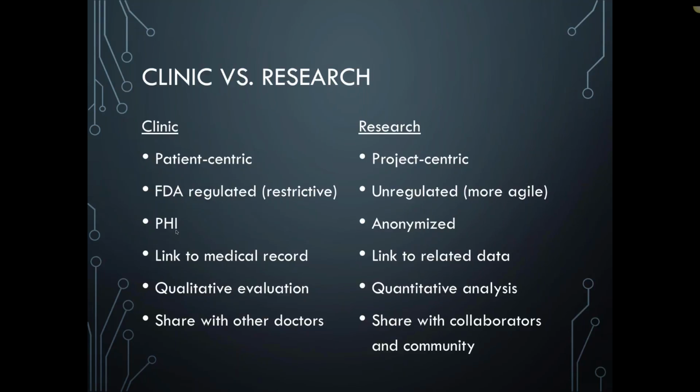In the clinic, doctors share the data, or the images, with one another in a somewhat open way. If you're in a hospital, the assumption is any of the doctors in the hospital are privileged to be able to access those images. So security is typically done at the level of restricting who within a hospital has access to the system and making sure that people outside the hospital don't.